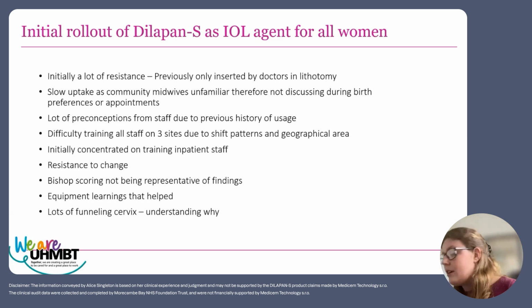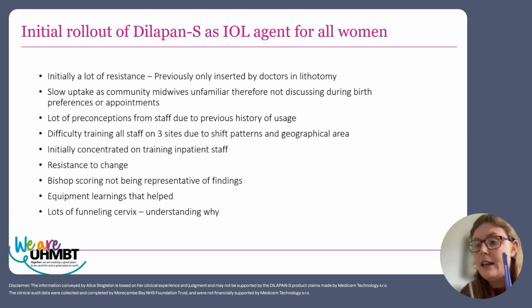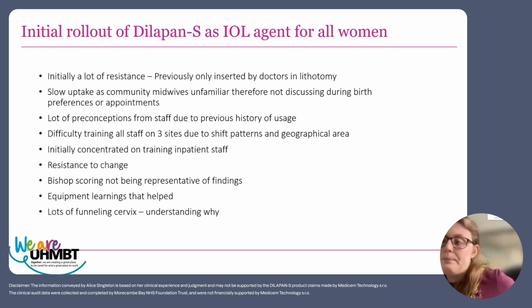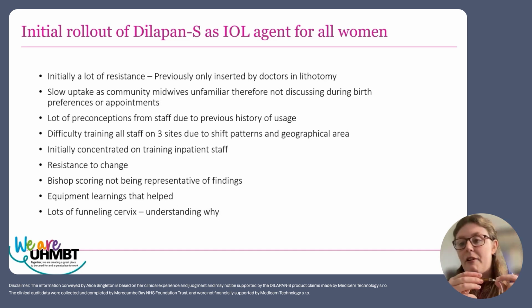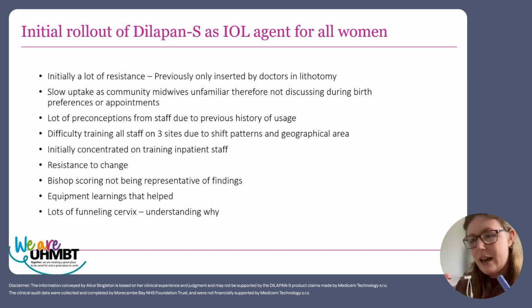So, they were really helpful. Another thing that really helped us was understanding the sponge holding forceps. Initially, as a cost thing, the trust invested in plastic forceps. But as those of you who use Dilapan know, the grooves on the plastic bit of the Dilapan don't match up to the plastic forceps. And so what happens is this.